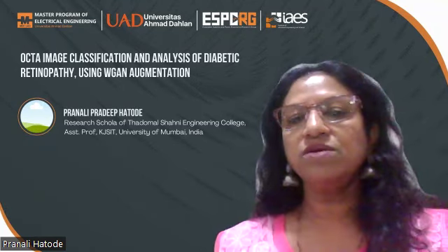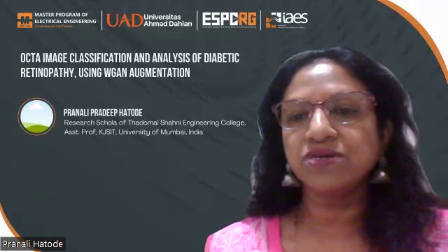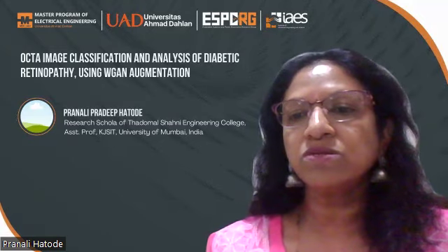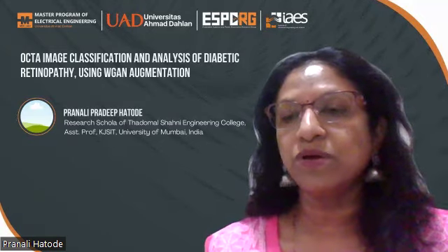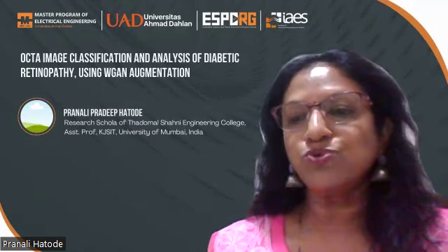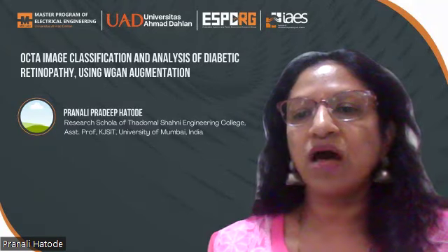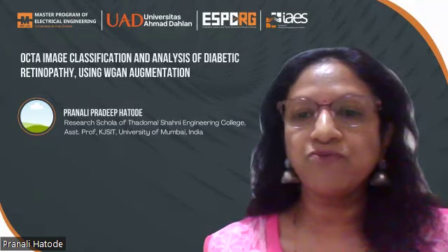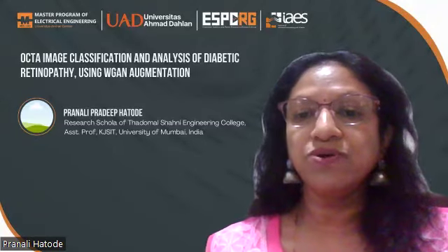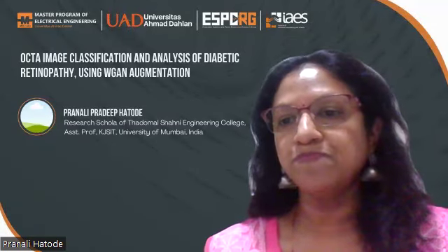Now, all of us know that deep learning has exhibited very good results for large data sets. But when the data set is limited, its performance gets a little bit lower. For this, we need augmentation techniques. Specifically, when it comes to medical images, many a time, diseased images are very few in quantity. We do not find them easily. In this case, we need to augment the data. We need to create synthetic data out of the original images to process them over a deep learning model.